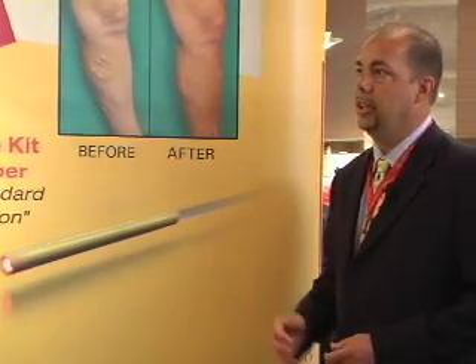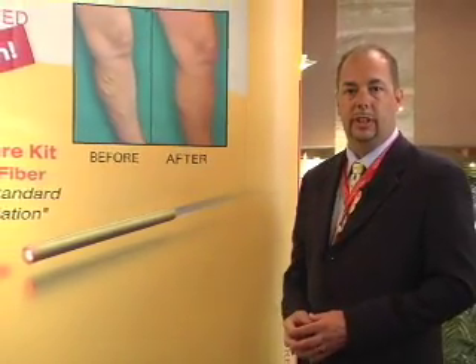This complete Angiodynamics Venocure system will give you results like this in almost every case.